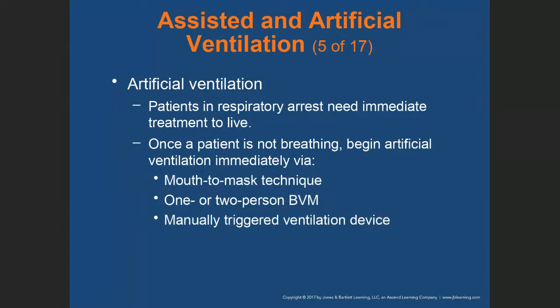We'll show you what that looks like when we come face to face. Now, artificial ventilation. Patients in respiratory arrest need immediate treatment to live. Once a patient is not breathing, begin artificial ventilation immediately. And the ideal device for artificial ventilation is mouth to mask technique.